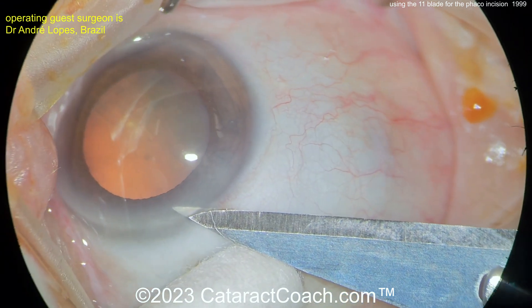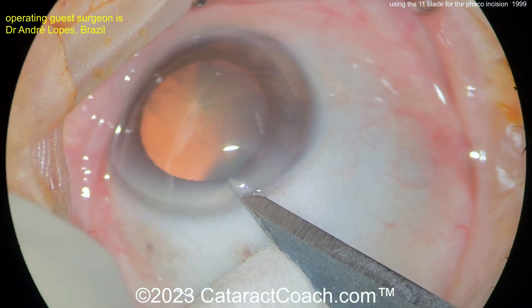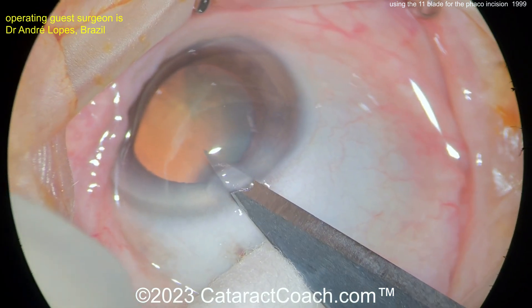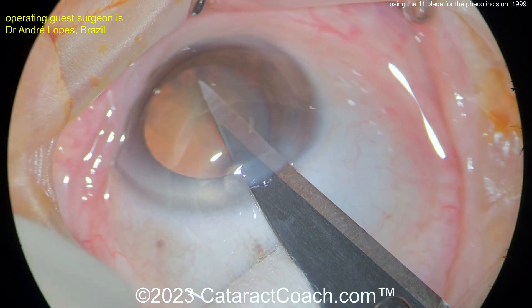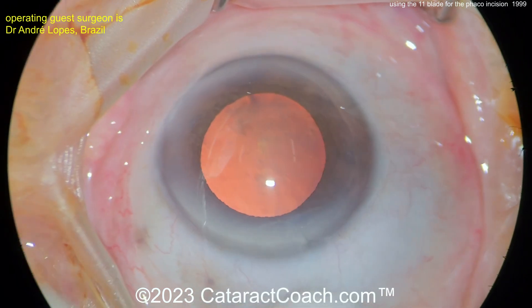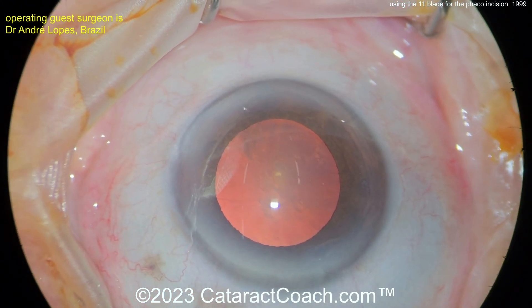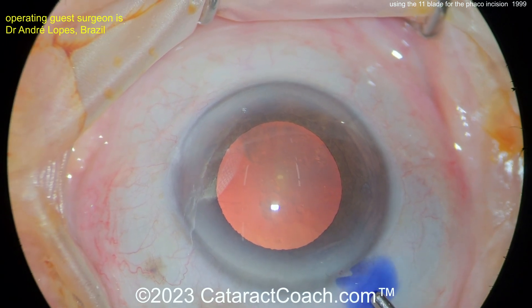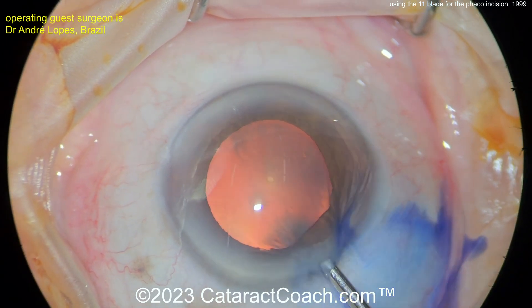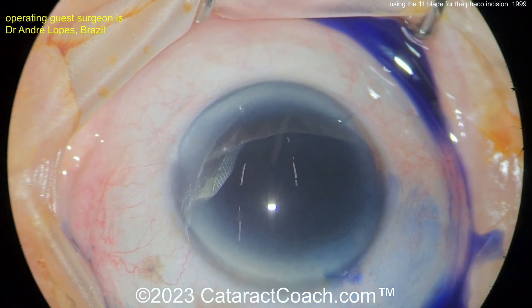You're going to be very cautious here because it's not the correct size blade, so you're going to have to adjust the way you do the incision. As you enter the eye, you need to widen it up. Because of the shape of the blade — look how long it is — look how far into the anterior chamber the blade went. You have to be very cautious because that blade went so far inside the eye.